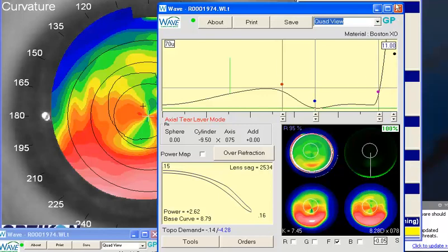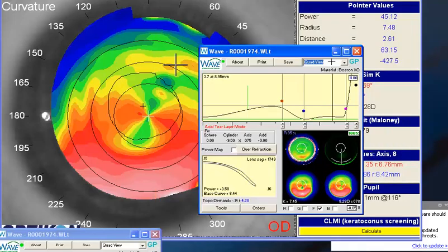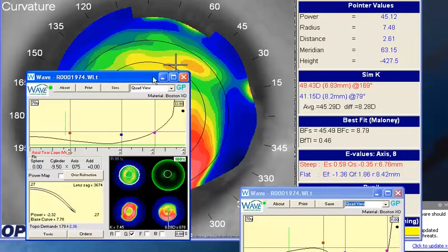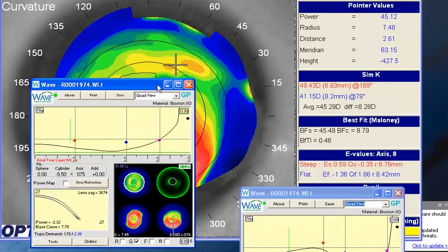But I would have done probably exactly what you're thinking of doing on that first design if I'm going to do a scleral design. Again, mine, I might try to get a little bit larger back OZ. The reality is it may not make that big of a difference when you get this lens on the eye. Well, I wish you well with this case. These are very challenging, as you know, and hopefully you'll be very successful with this design.